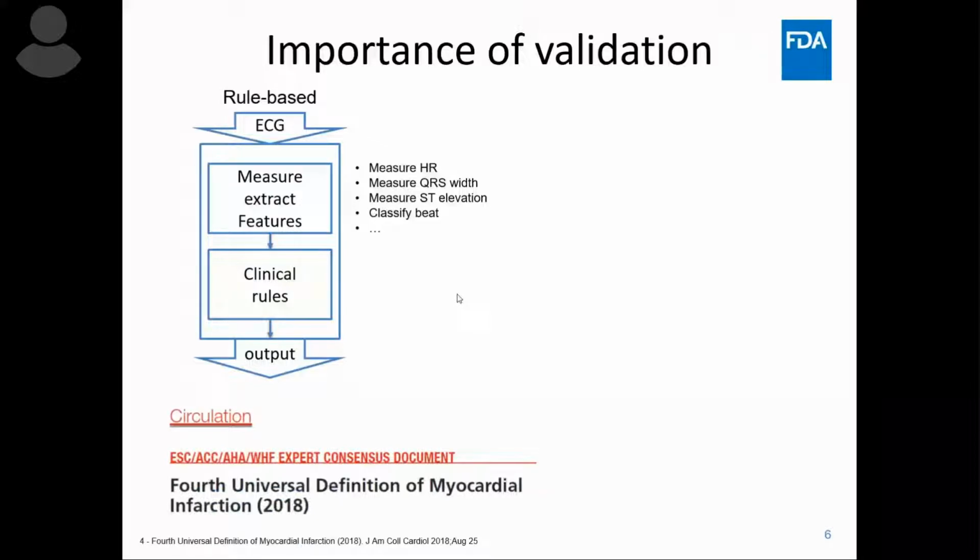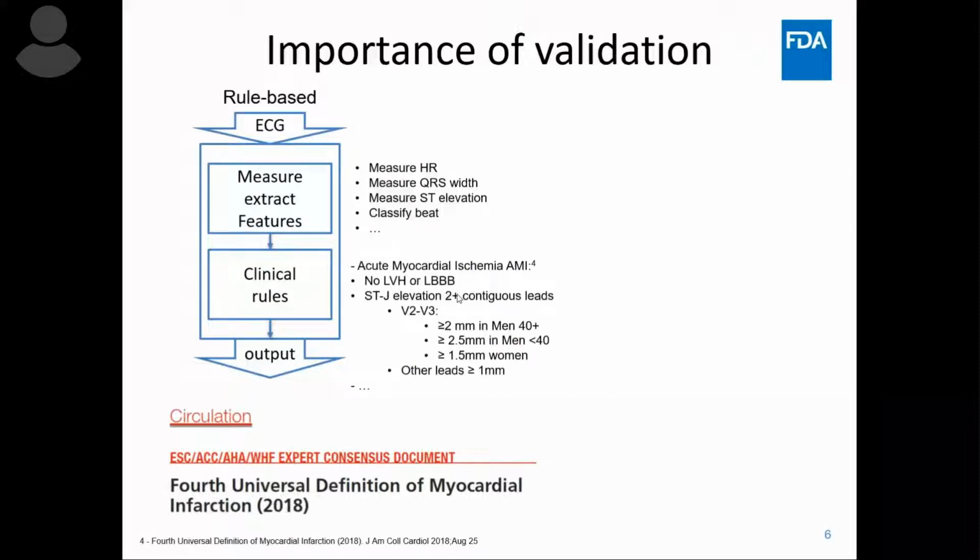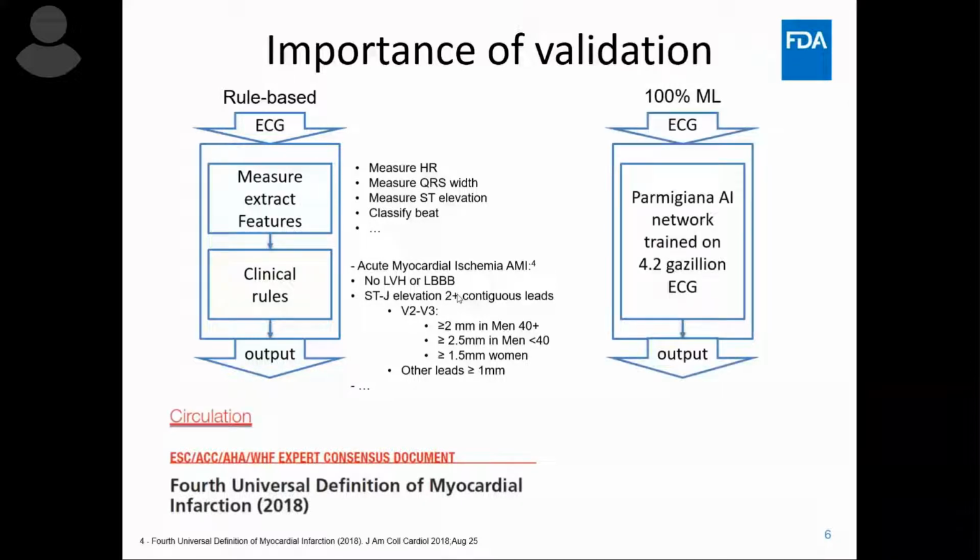It is an expert consensus, seems trustable enough. And what you do, you take this and pick up a rule for AMI, and the rule is here. You can set. So if you have a machine learning algorithm, you basically did your training of your model based on your data set, and you have an output.